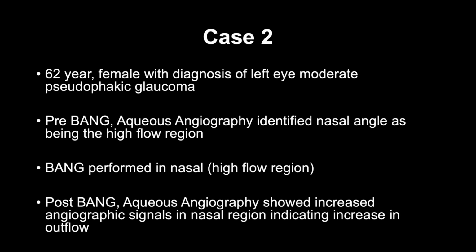Moving on to the second case of a 62-year-old female with left eye moderate pseudophakic glaucoma. Pre-Bang aqueous angiography identified the nasal angle as being the high flow region. Bang was performed in the nasal high flow region. Post-Bang aqueous angiography showed increased angiographic signals in the nasal region, indicating increase in the outflow.